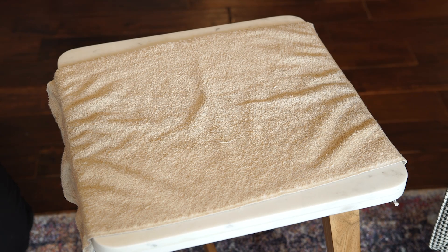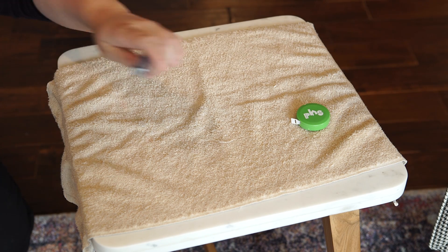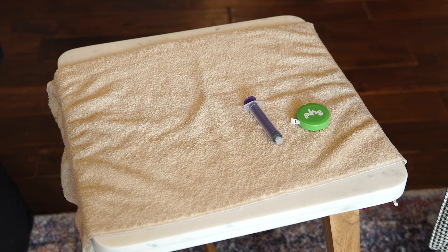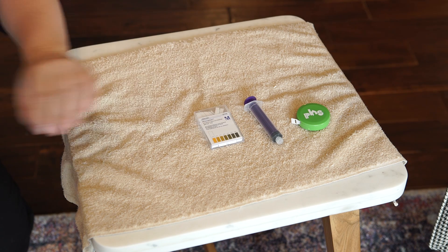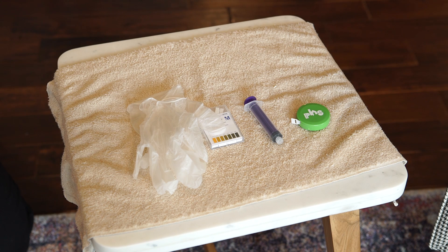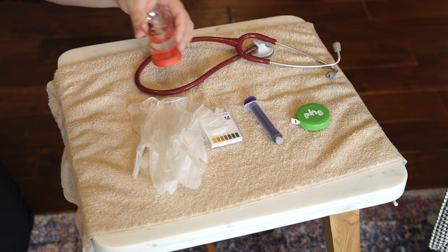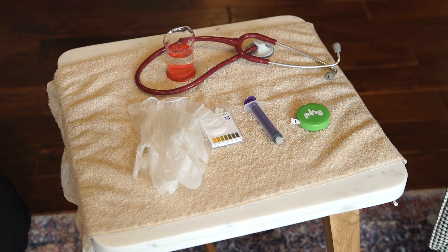Assemble the supplies you need to check the placement of a feeding tube: a flexible measuring tape, a syringe, pH strips, non-sterile gloves, a stethoscope, the type of water recommended for flushing the tube, and a clean container such as a measuring cup.